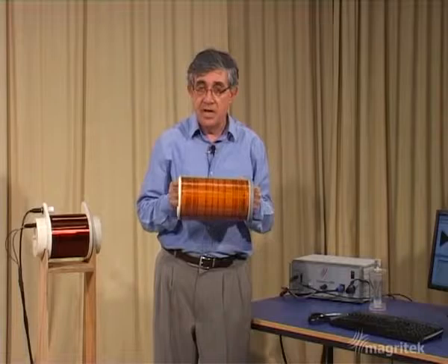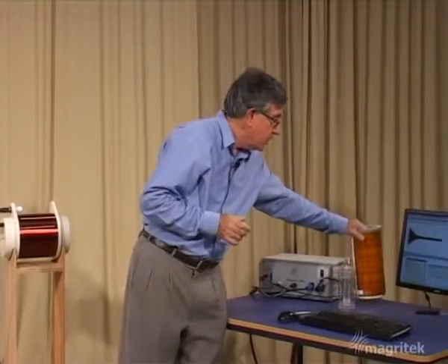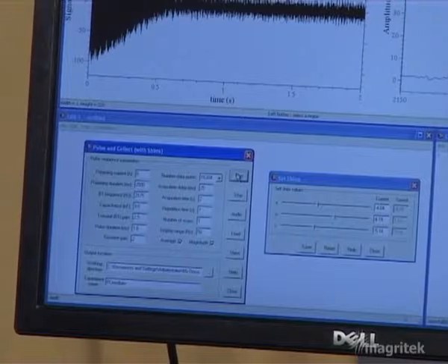And the Terra Nova is set up to do that through the software. We have these little slider bars here that enable us to adjust the currents. And I've previously set up the currents to produce just the best homogeneity we can with this apparatus. And I'm going to reset the current settings to those values.